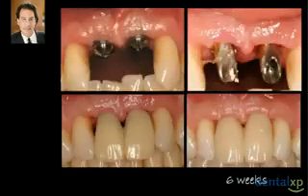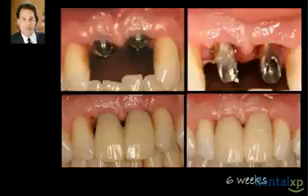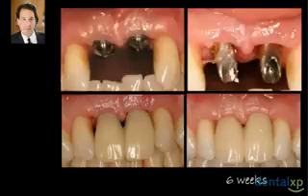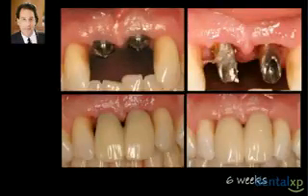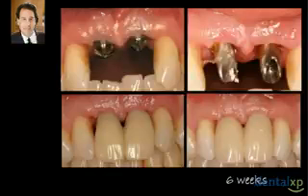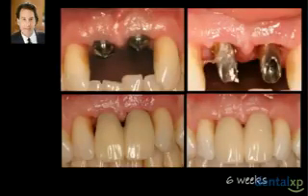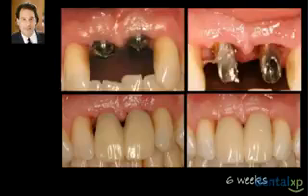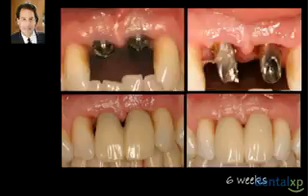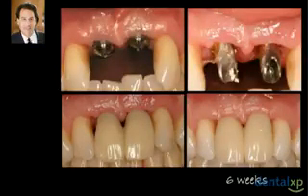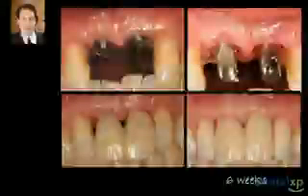Here's the same patient six weeks later with a little more soft tissue over the abutment. Notice the one on the right is completely covered, the one on the left is partially covered. A longer temporary healing abutment is then placed, and the patient goes back for provisional placement. Here's the left side the day of abutment placement and the right side six weeks later. Longer abutments are placed and the patient is placed into provisional restoration for six to eight weeks.